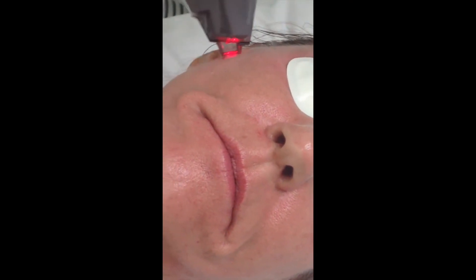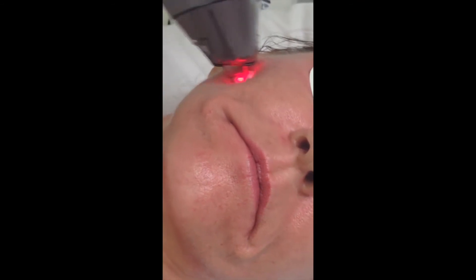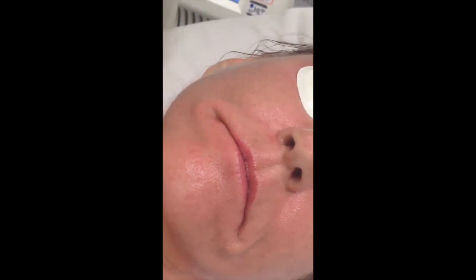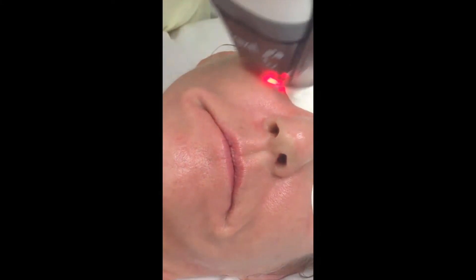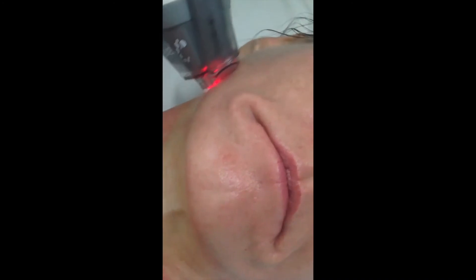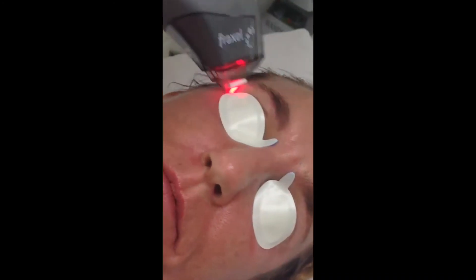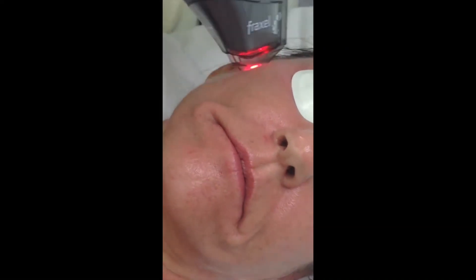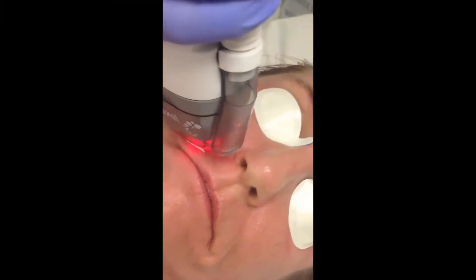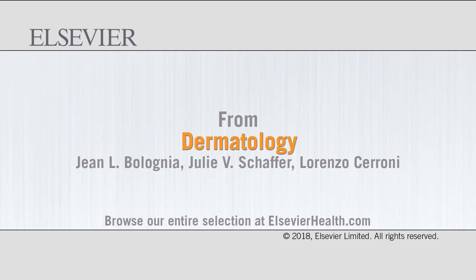I'm giving four passes here, same idea as before. This is probably getting about 200 microns into the skin. We're giving 35% density on top of the 11% density that we gave with the 1550. This is just one of the fractionated devices — there are many good systems out there, some scanning, others stamping, and you get exactly the same results with those other devices.